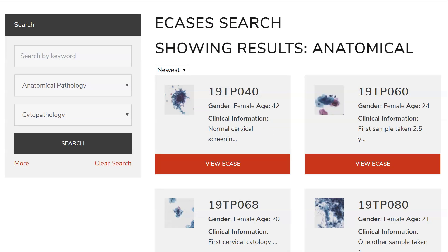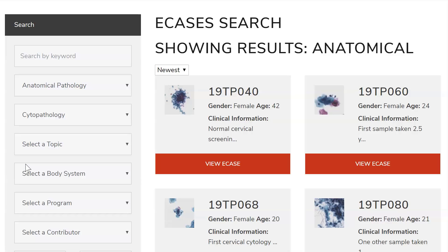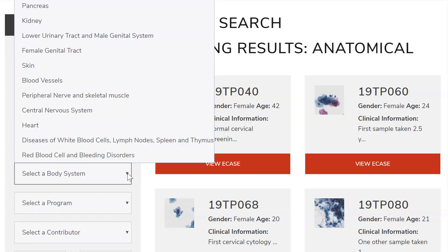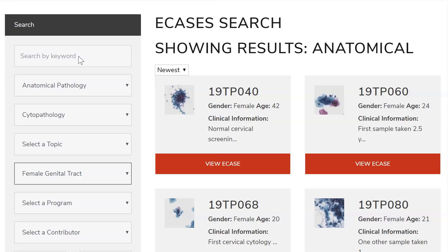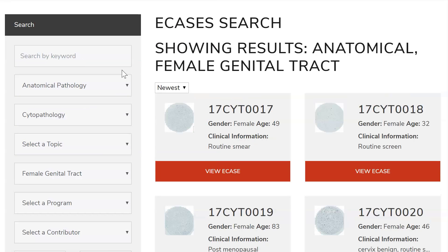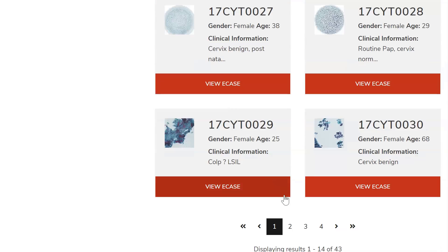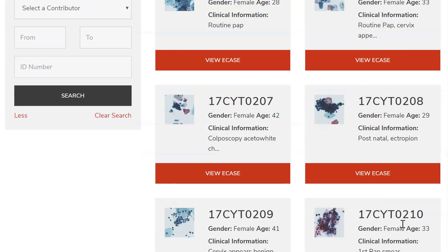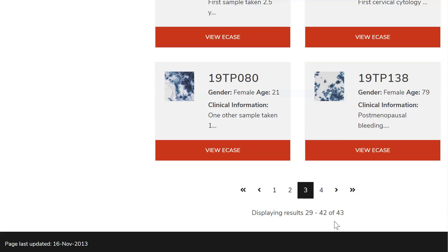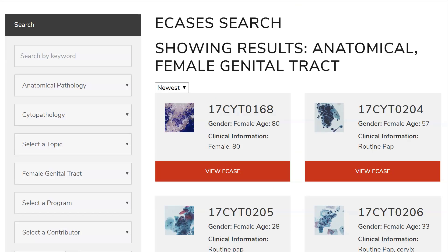And soon coming, there will be SP for sure path. To narrow the search for gynae cytology, click More and then select the body system Female Genital Tract. Now you can see these are all liquid-based cytology cases. Currently there are 43 gynae cytology cases with many more to come.